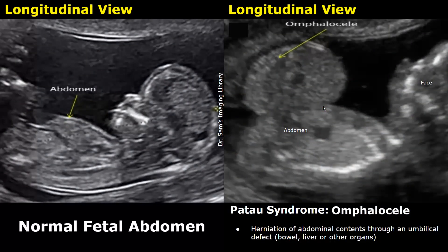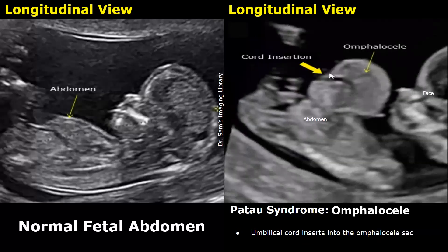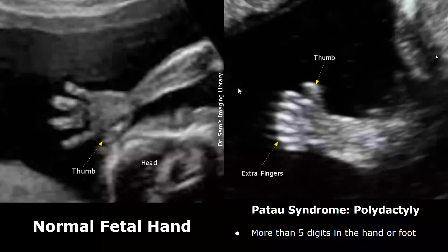Abdominal abnormalities may include omphalocele. Omphalocele is the herniation of abdominal contents through an umbilical defect. In this image, this is the omphalocele. The herniated contents are usually bowel or liver, but may include other organs as well such as the stomach. The omphalocele is usually present at the center of the abdomen. This protruding structure is the omphalocele sac, and the umbilical cord inserts into this omphalocele sac.